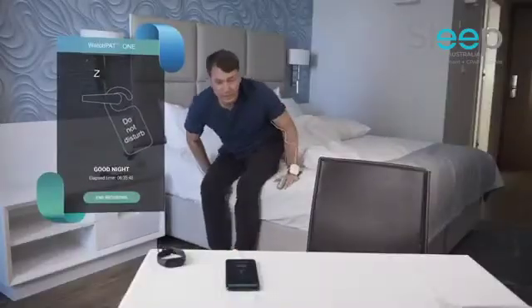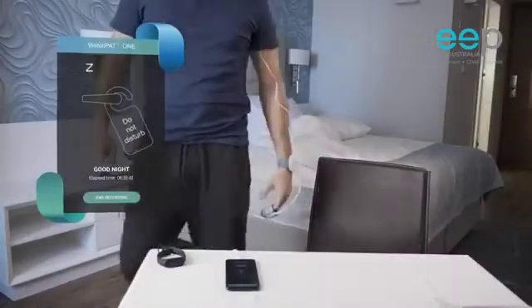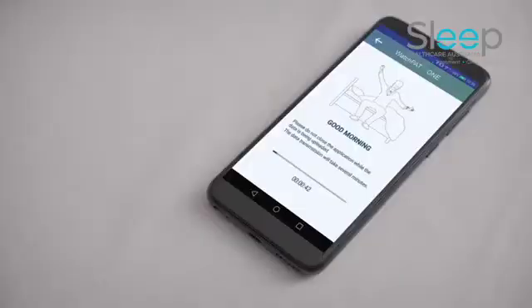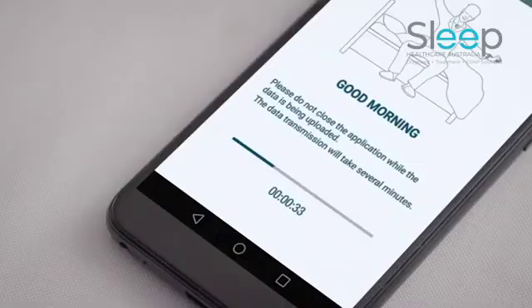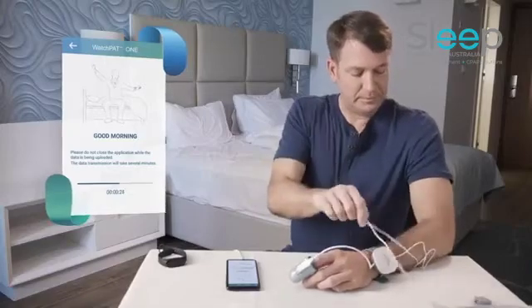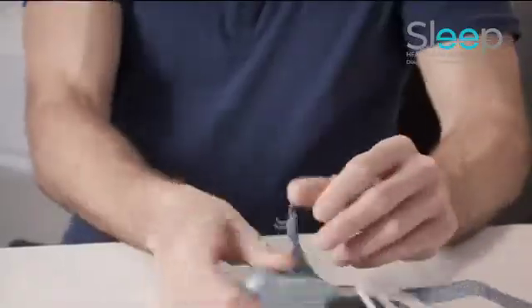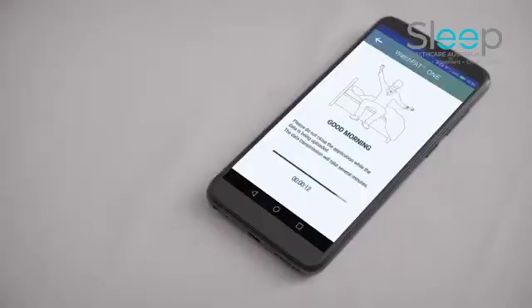In the morning, when you wake up, press end recording on the app. Wait for a few minutes until the device completes the data transmission. At this time you may use your mobile phone as usual, but stay within the device proximity. Remove the probe sensor and Watchpat 1 device. Once the data transmission has concluded, you will receive a thank you message.